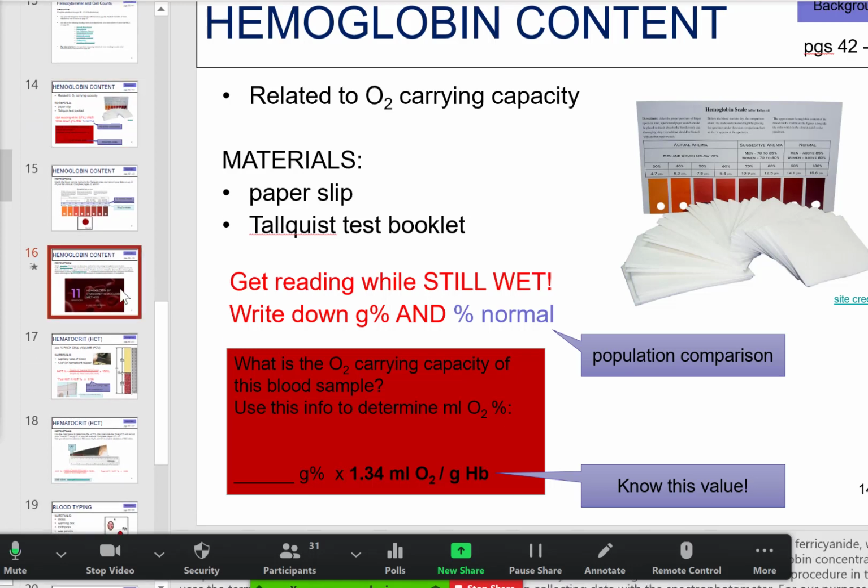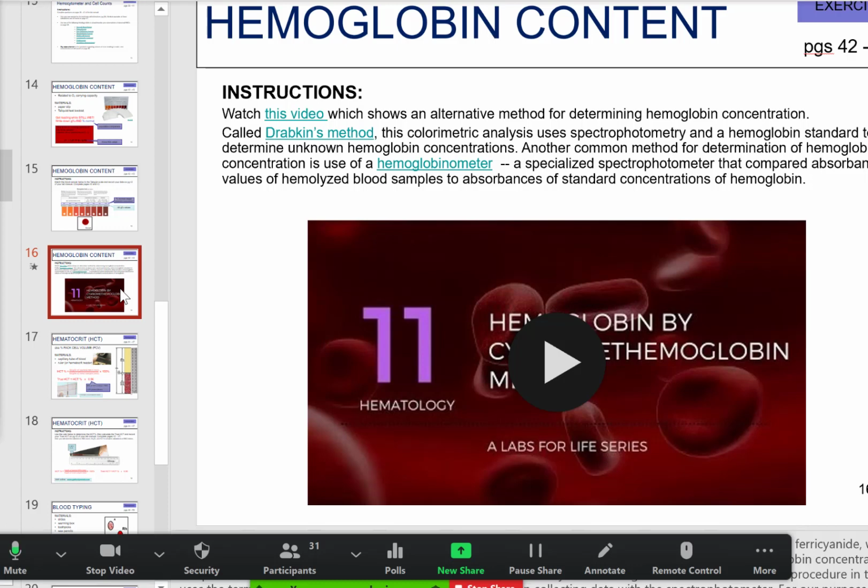Again, the PhysioX, as I mentioned before, is going to use a hemoglobinometer when you do that experiment. And a hemoglobinometer looks like, what were those things called? You know, those little kid cameras where you actually put in some little discs and you clicked on the little wheel mechanism and it was like watching a slideshow. Anyway, the hemoglobinometer looks like one of those.